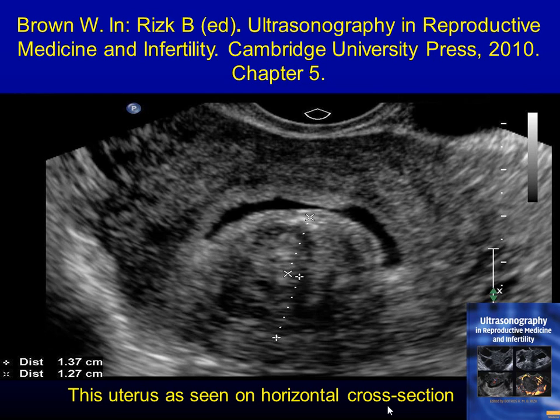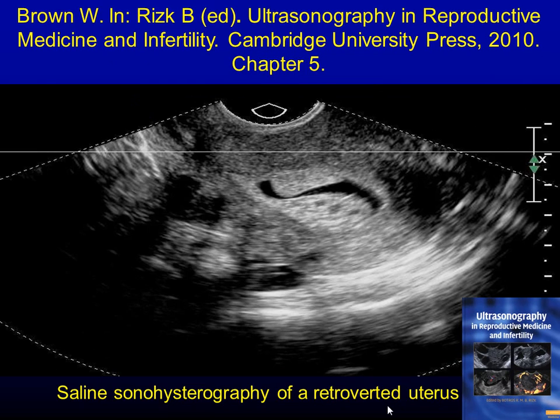So it is forewarning that if the fibroid is extending into the wall, then you need to resect part of the wall. This is a retroverted uterus, which is very easy to do on, the best way is just to do it by manual exam. But it changes the configuration totally.